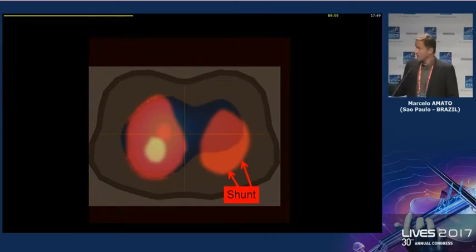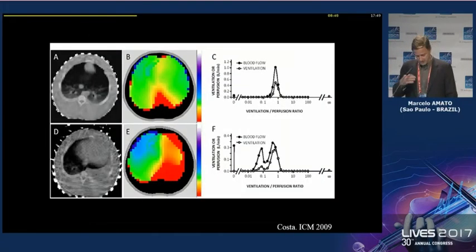And then we said to the surgeon, okay, you can just remove the lung tumor, and you are going to remove the occlusion here in the left bronchi, and then the case was solved and the patient went very well.